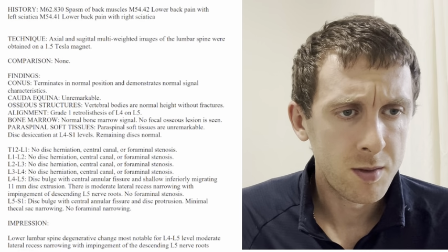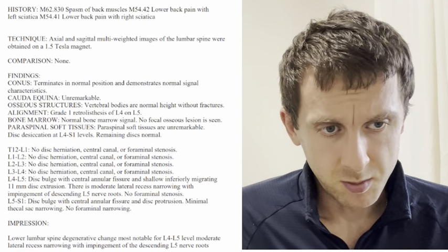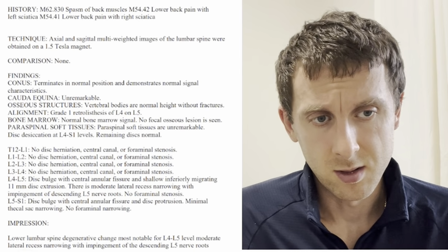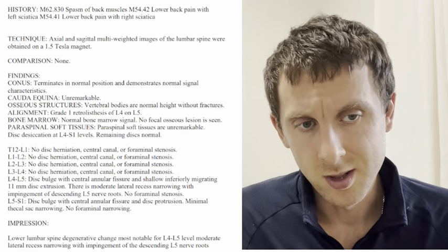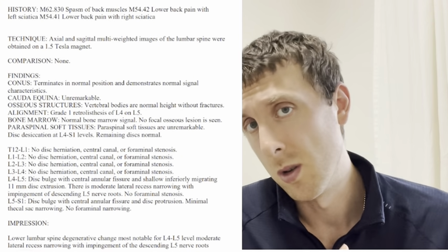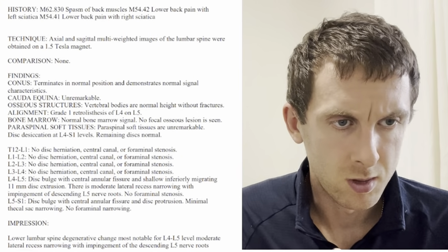That's something to be mindful of. Could be playing a role in some of the symptoms as well, but generally grade 1 isn't a significant amount of movement relatively. Of course, you'd have to see the photos to see if it's on the upper end of grade 1 or on the lower end, but regardless, it's what it says.